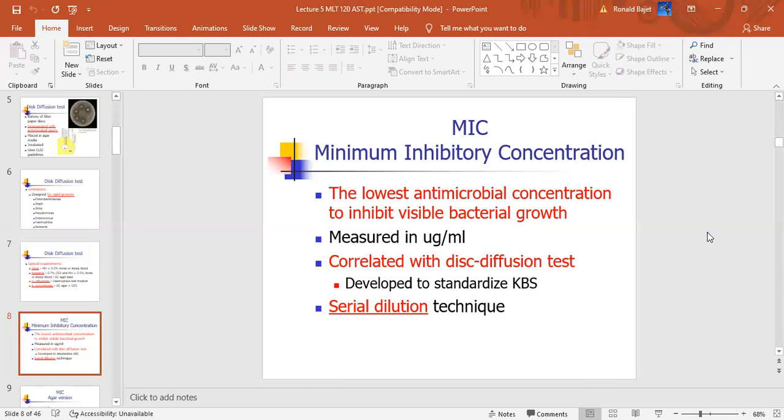Okay, so here the company will give you these plates with wells with these dilutions of antibiotic. What happens is you have a tube of organism, and into each well, this suspension has to be, and we're going to be doing this when we do the Kirby-Bauer, a 0.5 McFarland Standard.